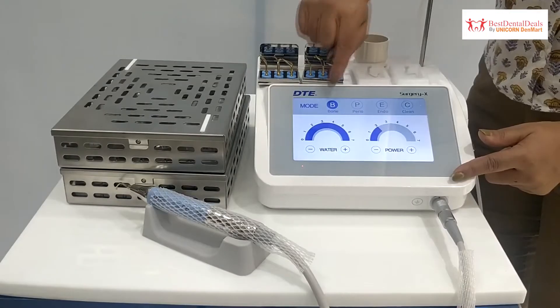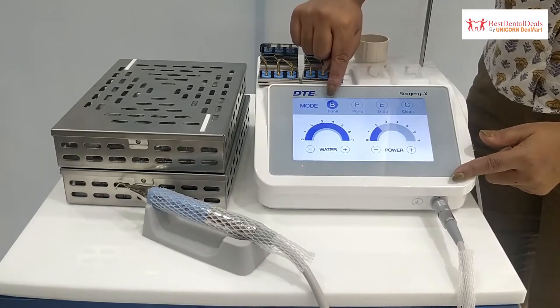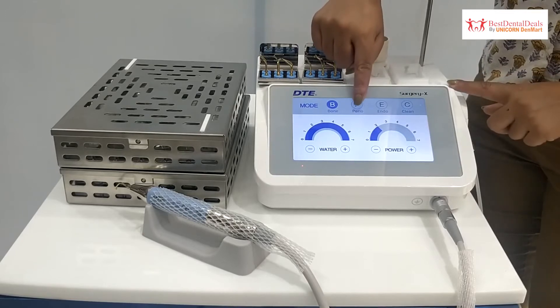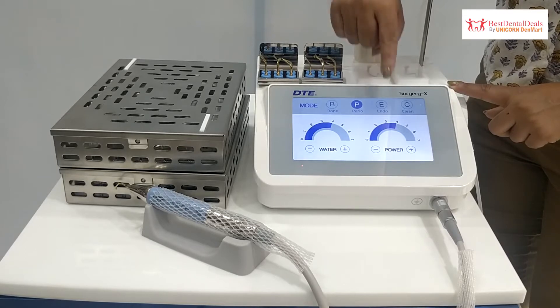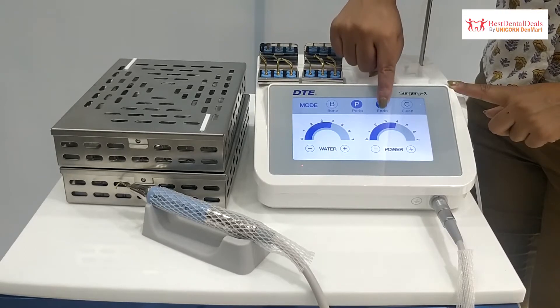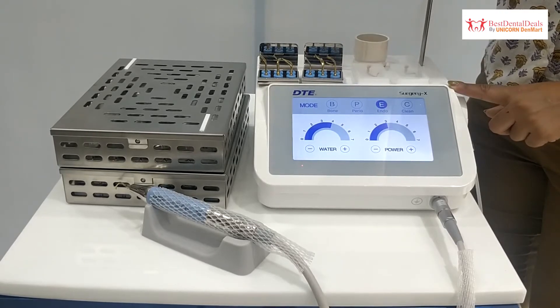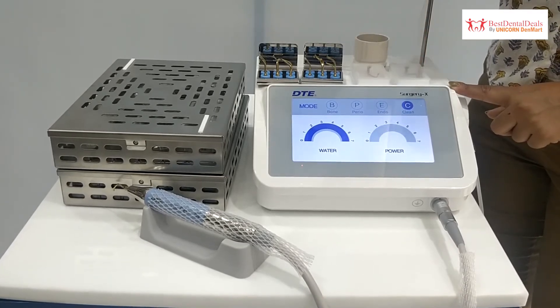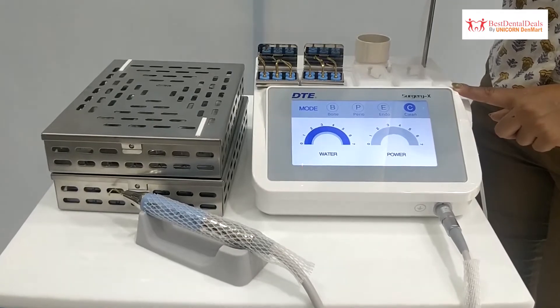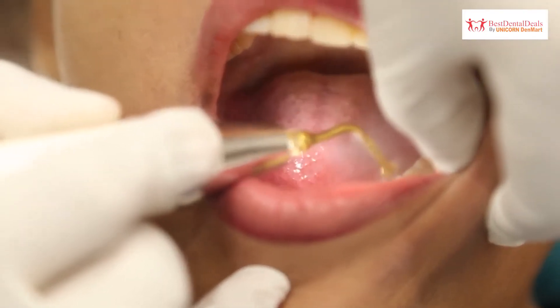Bone mode, or cutting mode, is for bone cutting or surgeries. Periodontal mode is for deep scaling, root planing, and curettage. Endodontic mode is for retrograde endodontics. Cleaning mode is used to disinfect the handpiece tubings before and after every patient, preventing cross contamination.